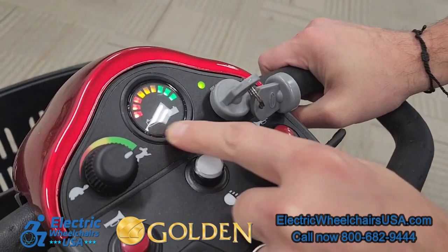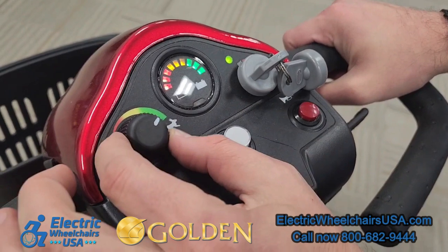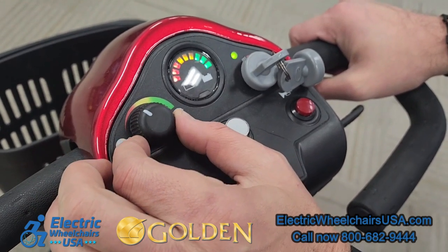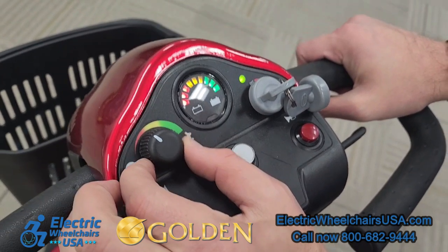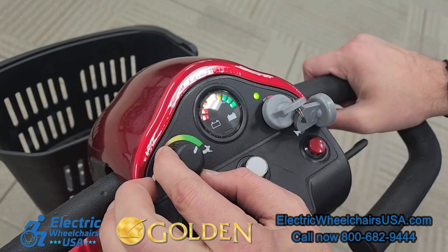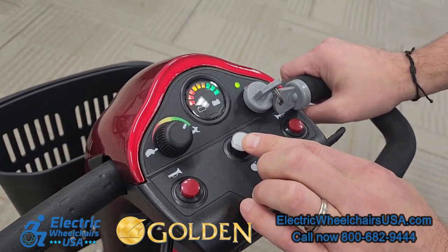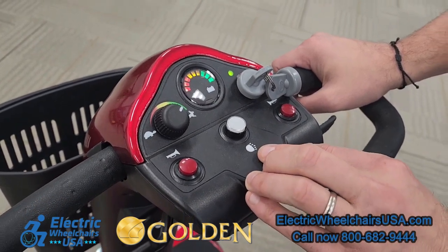On the left side is the speed control dial. If you turn it all the way to the right towards the rabbit, you can get up to the four-and-a-half mile per hour top speed. If you want to slow it down, you turn it to the left towards the tortoise, which decreases the speed to about two miles per hour — good for riding in a store or around crowds. It comes with two keys, the two red buttons are the horn, and the white button in the middle is the lighting package, which turns on the headlight and the two rear taillights.